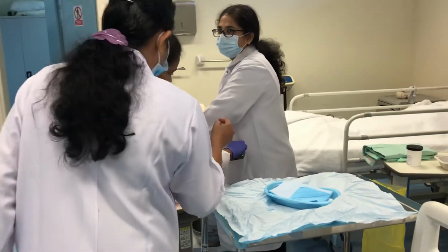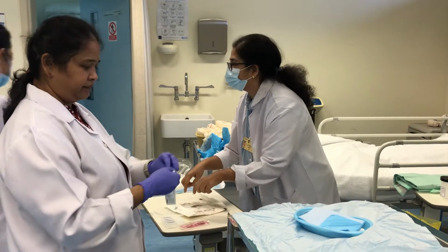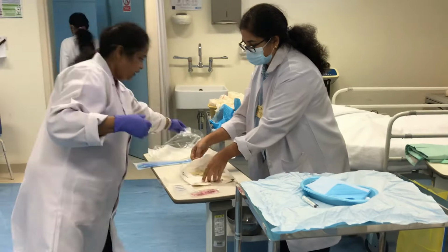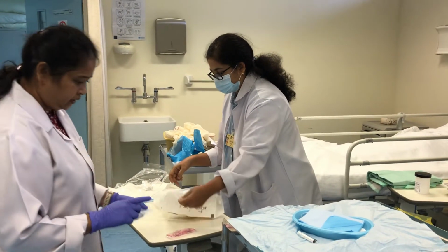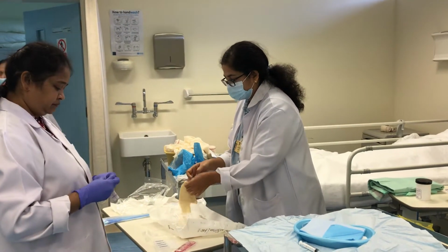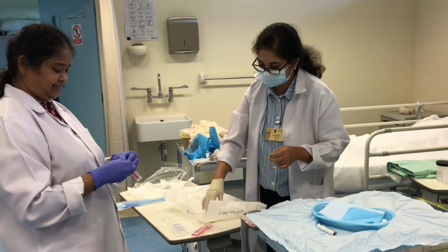Rinse here, just rinse it. Give it there. If other things, we can help. I'm going to wear my gloves just like the other procedure, skin to skin, so glove to glove.